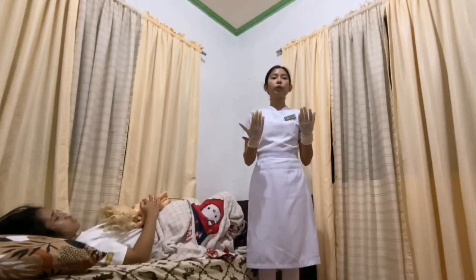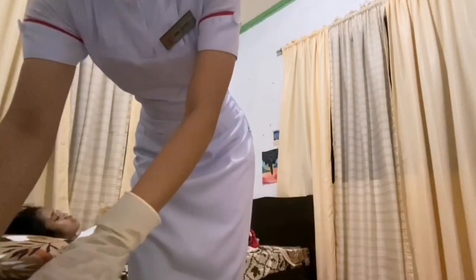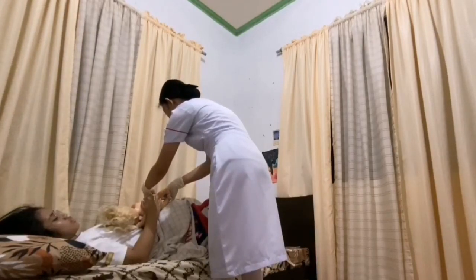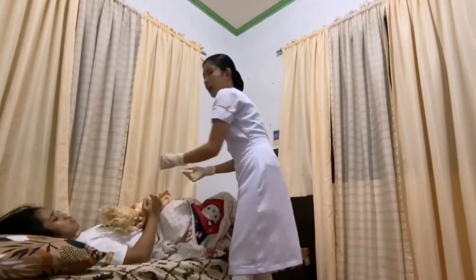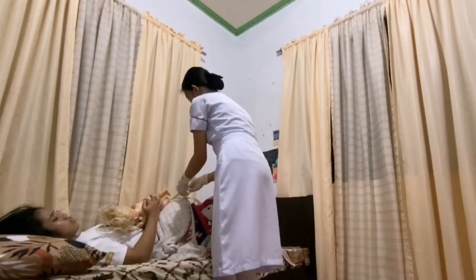After that is to clamp and cut the cord within 1 to 3 minutes after birth. Put a sterile cord clamp tightly around the cord at 2 cm and 5 cm from the baby's abdomen. Cut between ties with a sterile instrument and observe for oozing. So I'll be using a cord clamp on 2 centimeters. And then a sterile forceps at 5 centimeters. After that is to cut it using a sterile instrument.